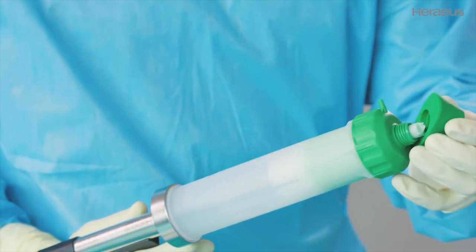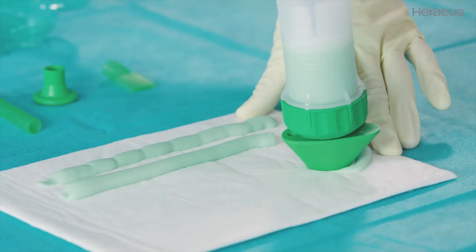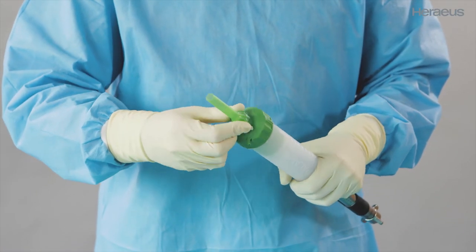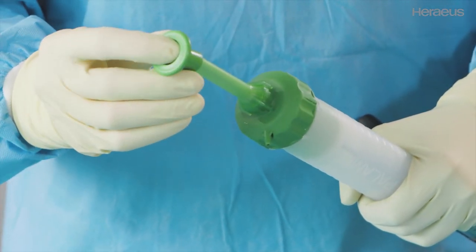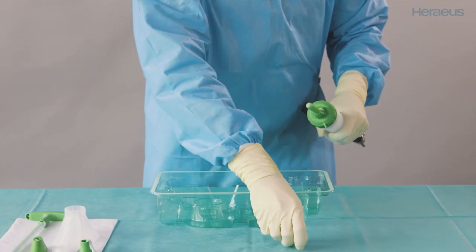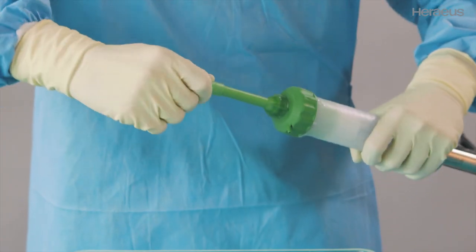Use the femoral pressurizer to apply pressure during cemented hip surgery. For knee surgery, a short nozzle is included in the Palomix set. Attach the knee pressurizer to the short nozzle to apply pressure during cemented knee surgery. To apply a thin layer of bone cement, attach the spatula clip to the short nozzle.